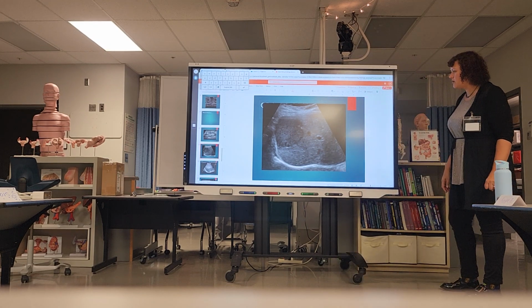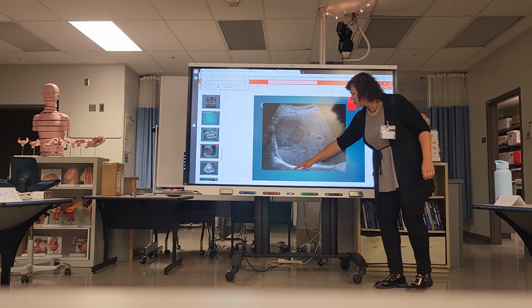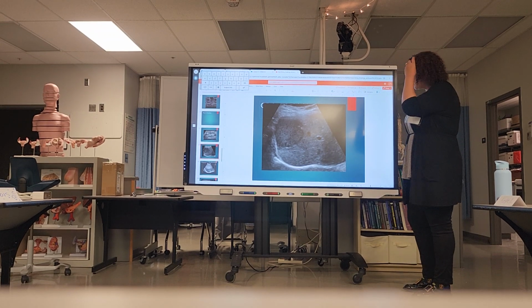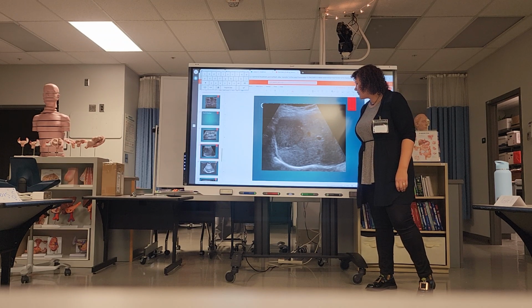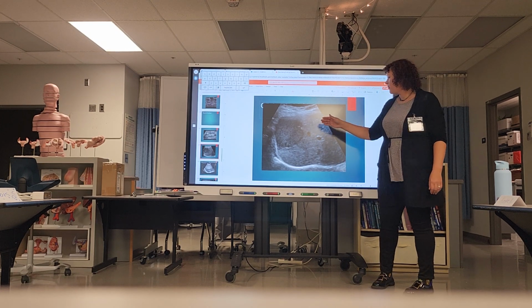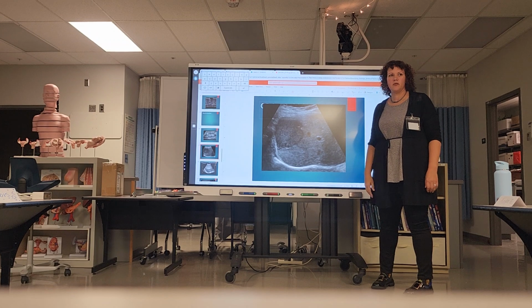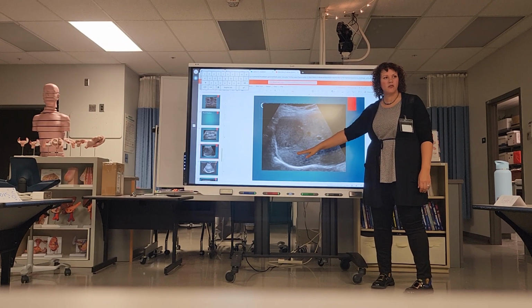Is it a solid or is it cystic? Solid. How do we know? No enhancement. That's right. So I would describe this as a hypoechoic solid mass in the liver with no posterior enhancement. It doesn't look like there's a fluid component in this at all.